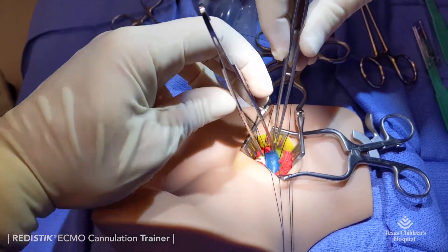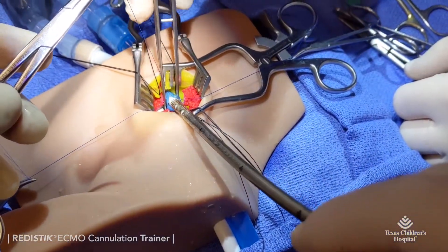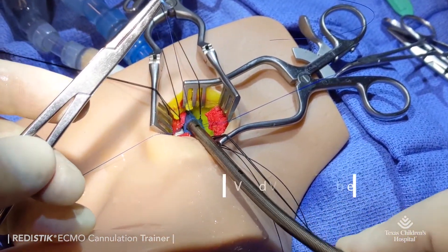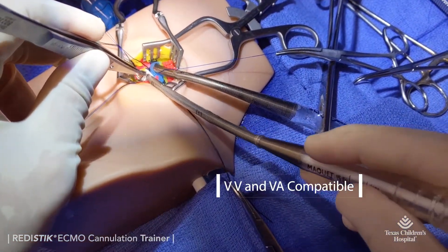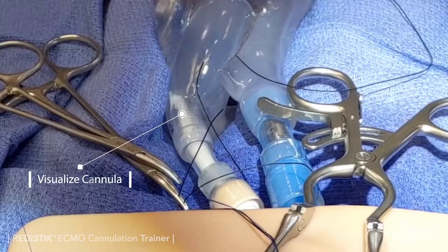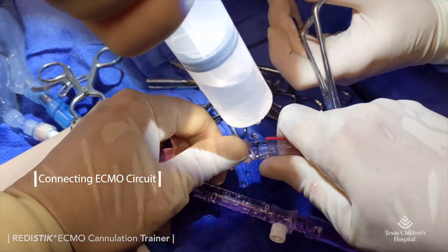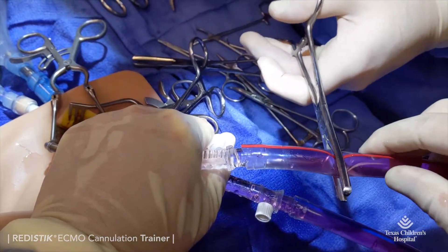The ReadyStick ECMO cannulation trainer is the only neck simulation task trainer currently available, providing surgeons and the ECMO team the ability to practice all procedural steps for venous and arterial ECMO cannulation, visualization of cannula placement, connecting to the circuit, and troubleshooting skills. It will improve confidence, efficiency, and speed for any skill level.